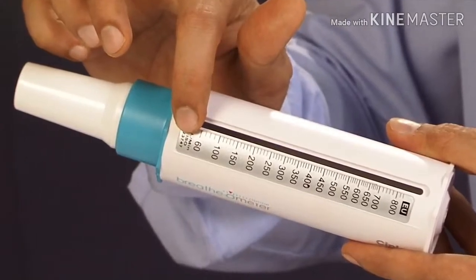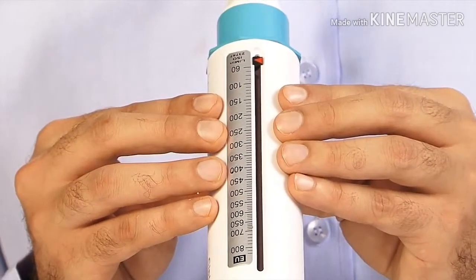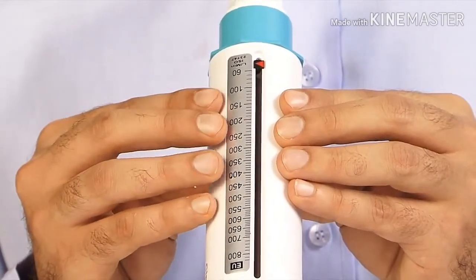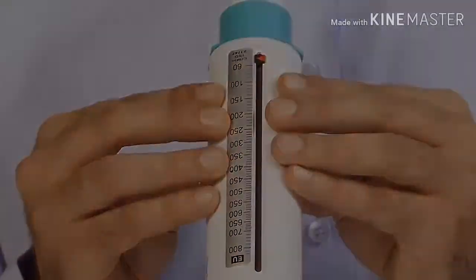Hold the breathometer so that your fingers are away from the scale and slot while holding the device. Do not press hard with your fingers, because this may damage the device and affect the reading.